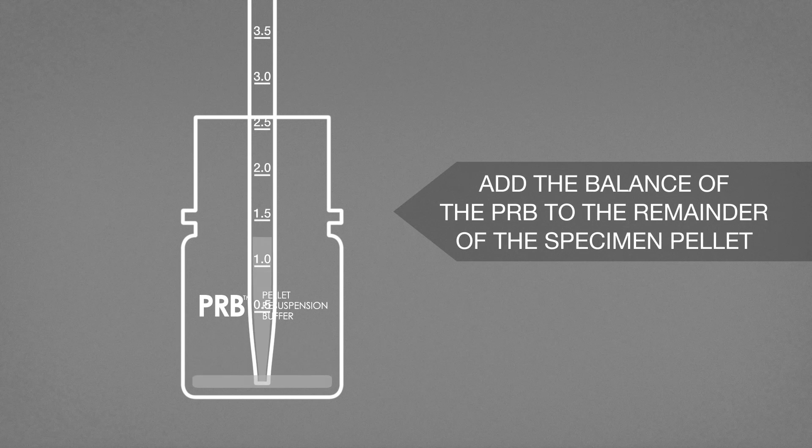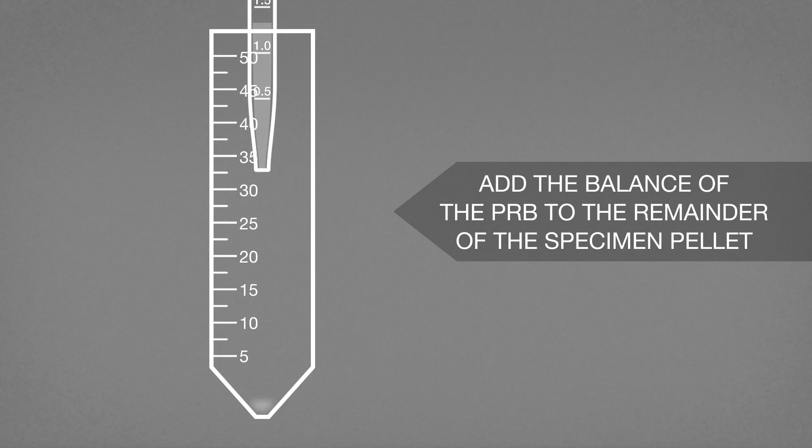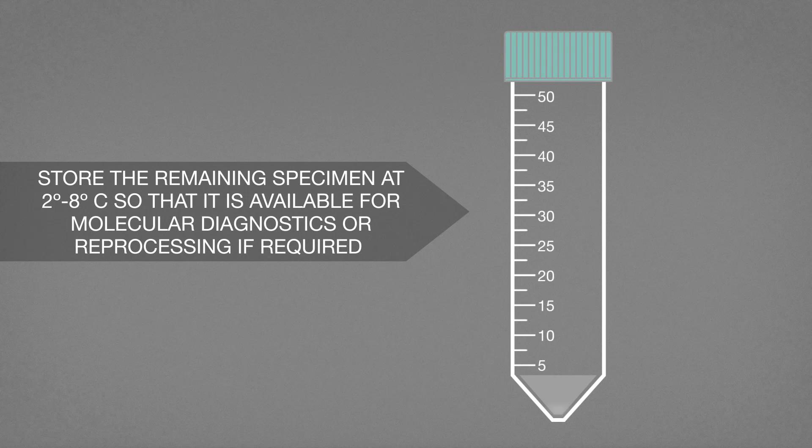Add the balance of the PRB to the remainder of the specimen pellet. Cap the specimen tube. Store the remaining specimen in a smaller tube if necessary at 2 to 8 degrees Celsius so that it is available for molecular diagnostics or reprocessing if required.